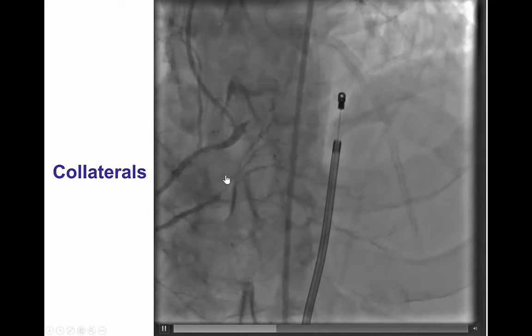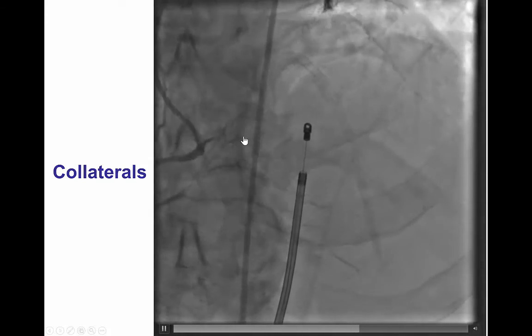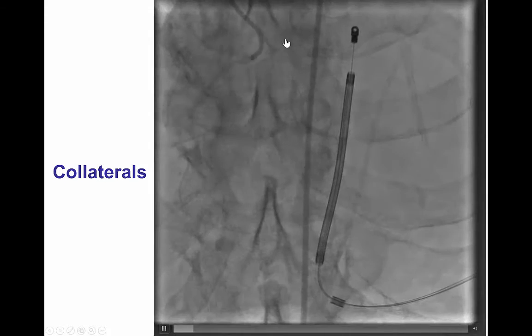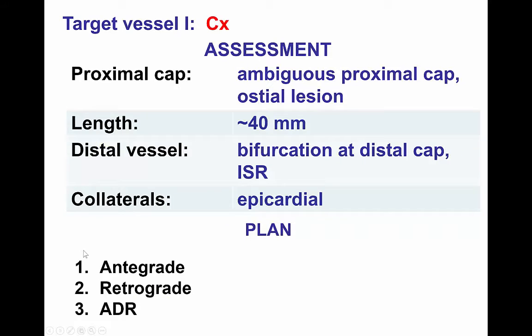The distal RCA and the right posterolateral were giving epicardial collaterals to the distal circumflex. In summary, we have a lesion with an ambiguous proximal cap in the circumflex, length about 40 mm, a bifurcation on the distal cap, and the CTO is within the previous stent. The collaterals are epicardial.